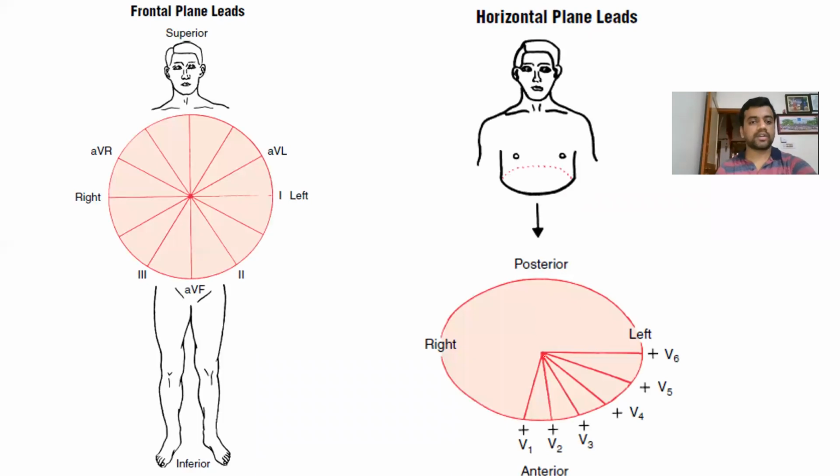Okay, I think almost everybody has joined, and we'll continue with the limb leads and the chest leads. Whatever limb leads and chest leads I showed you previously, I'll show you one more time. These are the 12 leads which you just saw.